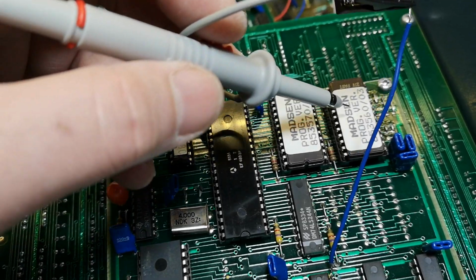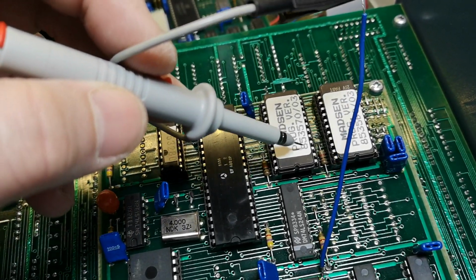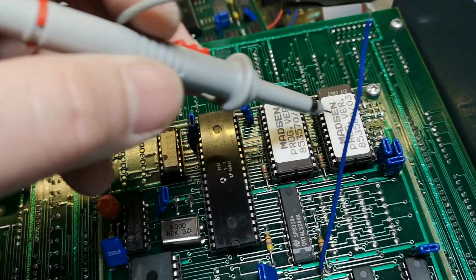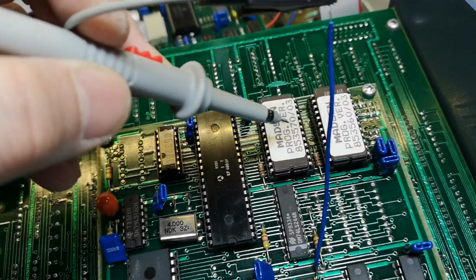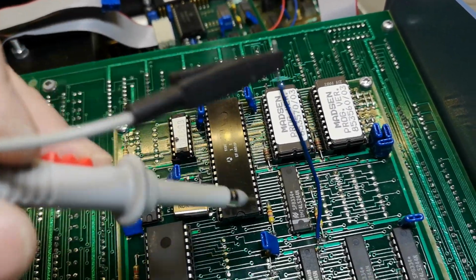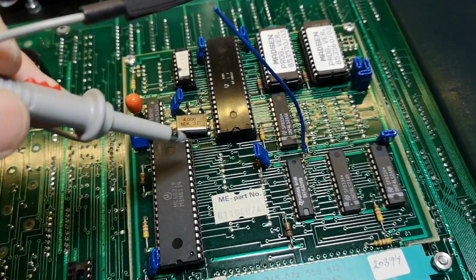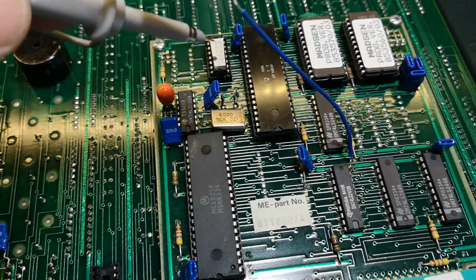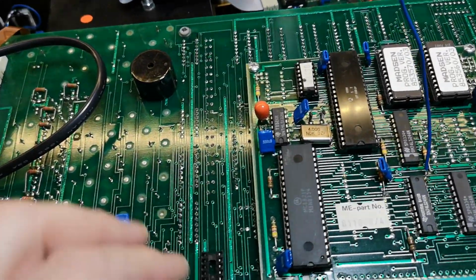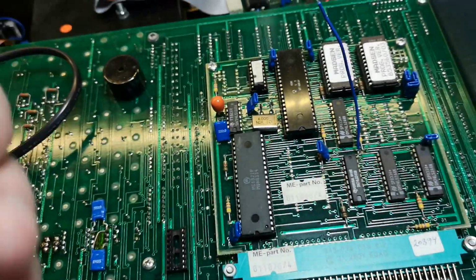There's actually a known problem with EPROMs and aging, and they don't really last forever. So it could be that 1985, I think they're just so old that half of the bits are gone here and there, and that means the program can't really run correctly, and this is why nothing happens, because I don't really find anything that is obviously wrong, and I don't have the schematics or anything really, so there's not a lot more I can do just to confirm that, yeah, all the scan signals there, here, the buttons and all that kind of stuff, it goes all the way in, but nothing really happens.